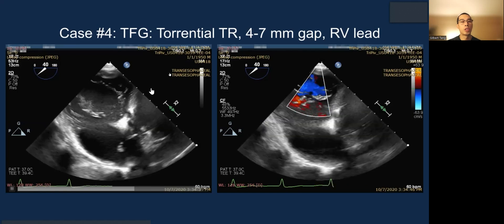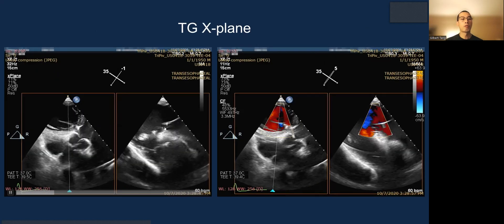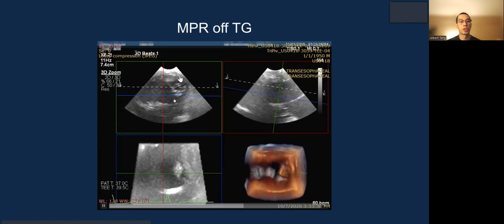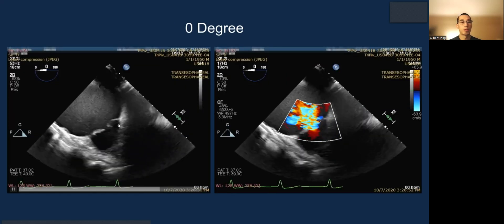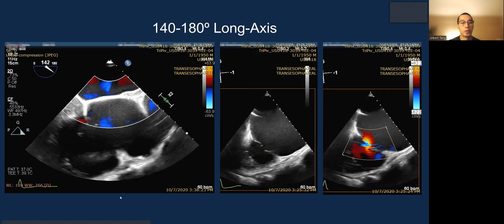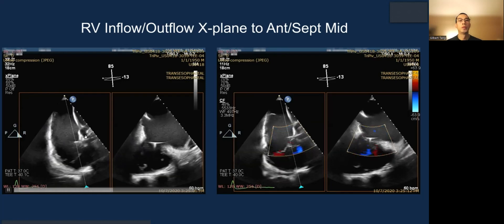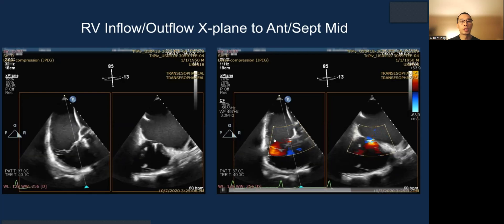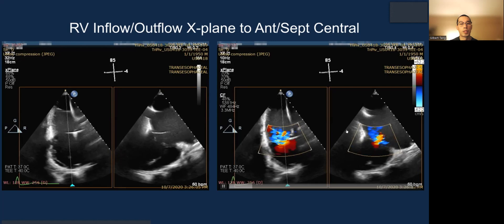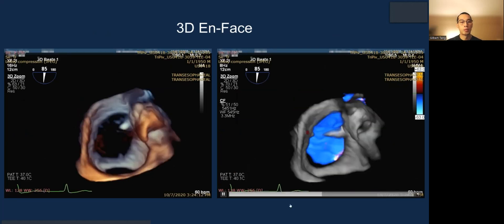Case 4: torrential TR with a much larger gap and a lead right at the anterior septal commissure, draping there. You can see it crossing the tricuspid valve. The MPR view looks fantastic and shows the grasping position and en-face view well. The inflow X-plane is probably better here. With the long septal leaflet visible, the lead is tucked into this area. Starting with anterior septum and a sweep, there is a bit of a jet but the lead requires caution. Moving to posterior septal uses the same principle, and 3D en-face confirms the anatomy.